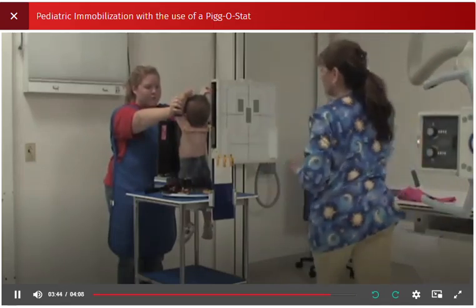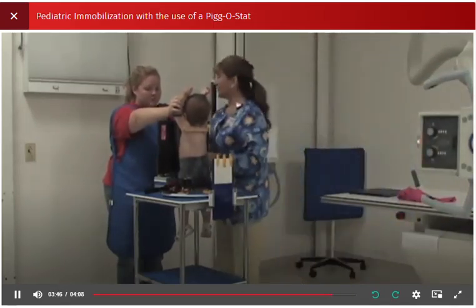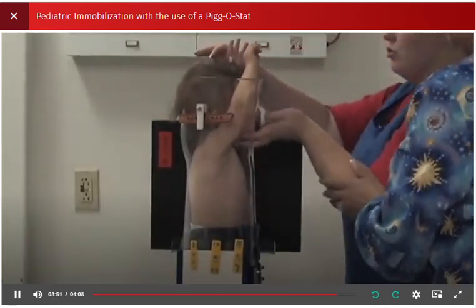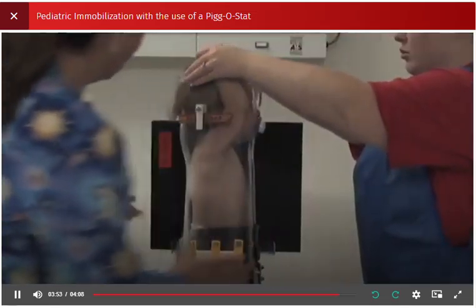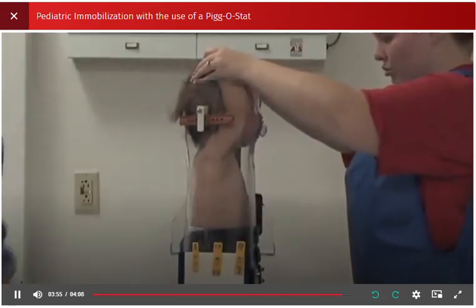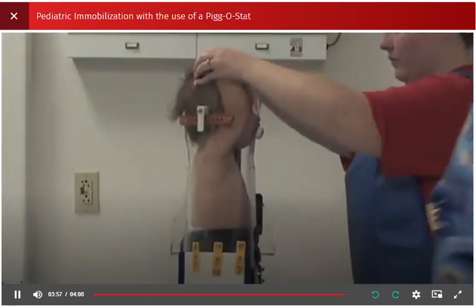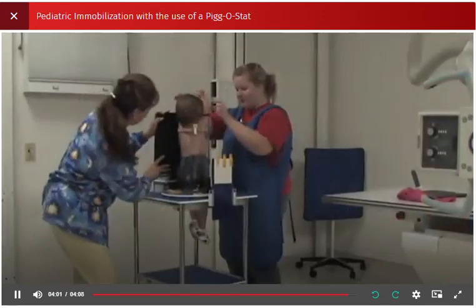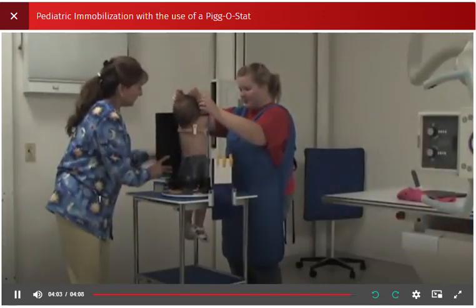After the exposure has been made, adjust the technique for a lateral position. Rotate the seat platform base to 90 degrees to obtain a true lateral. Quickly and carefully remove the image receptor and replace it with an unexposed image receptor. Have the parent continue to stand in front of the patient and once again wait for a deep inspiration and expose.